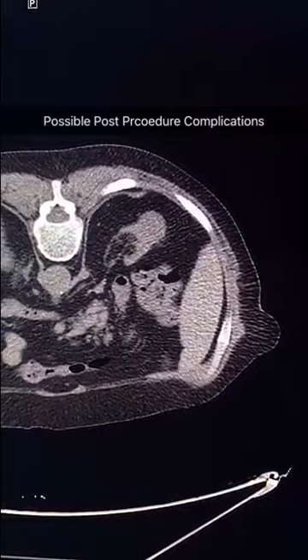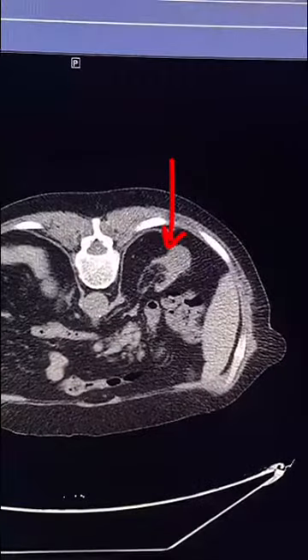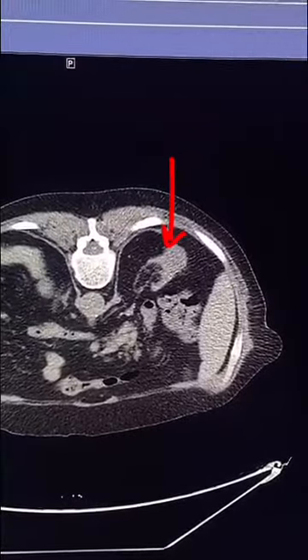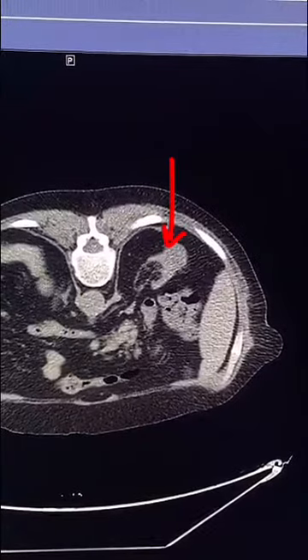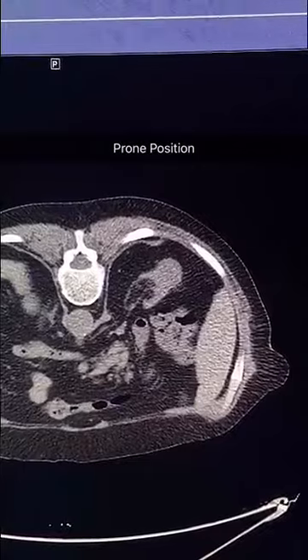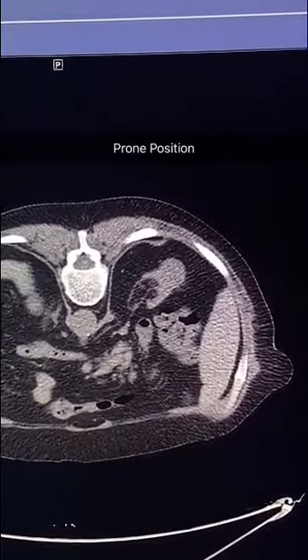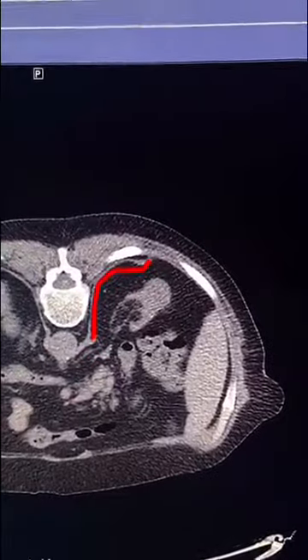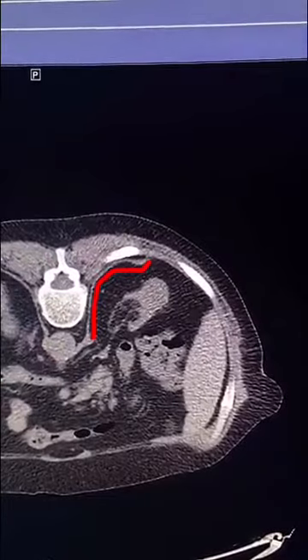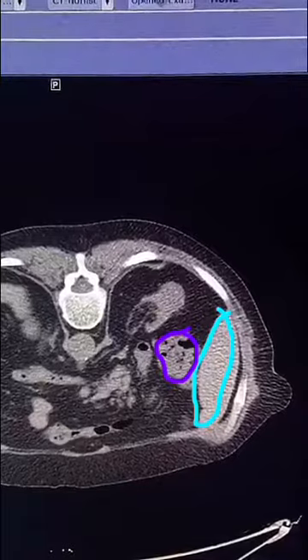The interventionist should study the imaging prior to the procedure and should decide the best access in order to do the RFA. I decided that the best approach is to go from the back straight down into the lesion, asking the patient to lie prone. I notice that the right diaphragm is in my way, but with careful preparation and using a coaxial needle, the risk of pneumothorax is very low. With this position, I have enough space between the lesion and the colon, as well as the right lobe of the liver.